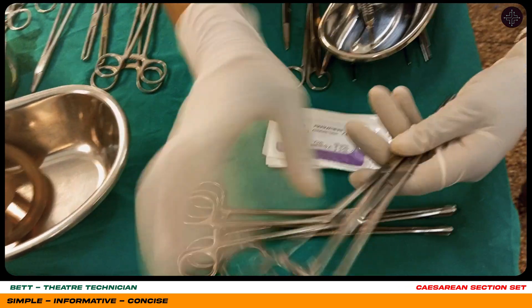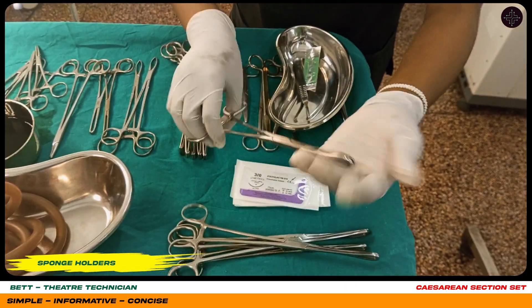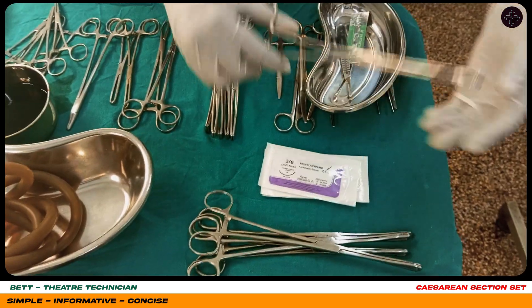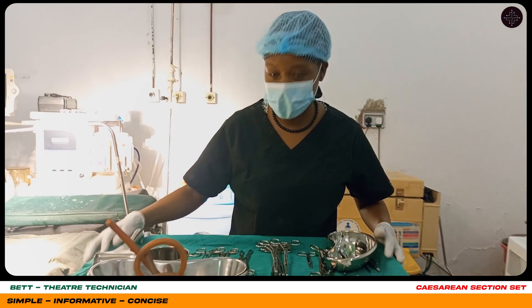Here are our sponge holders. These are used for holding gauzes — swabs. After the gauze has been placed on it. Thank you for your time guys.